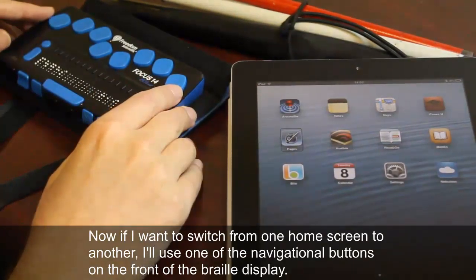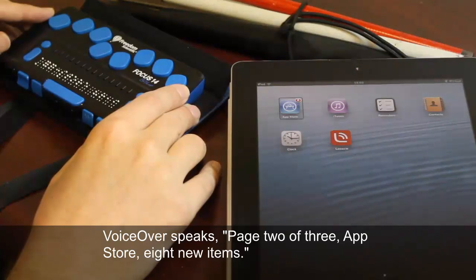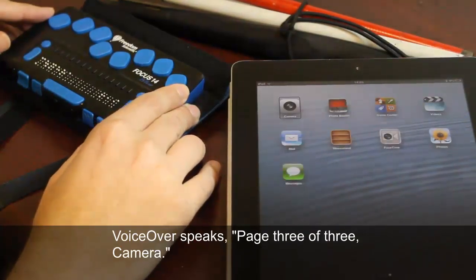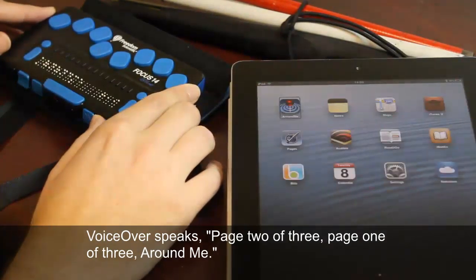Now if I want to switch from one home screen to another, I'll use one of the navigational buttons on the front of the Braille Display. There's page 2, page 3 of 3 — Camera — and now I'll move back to page 1.